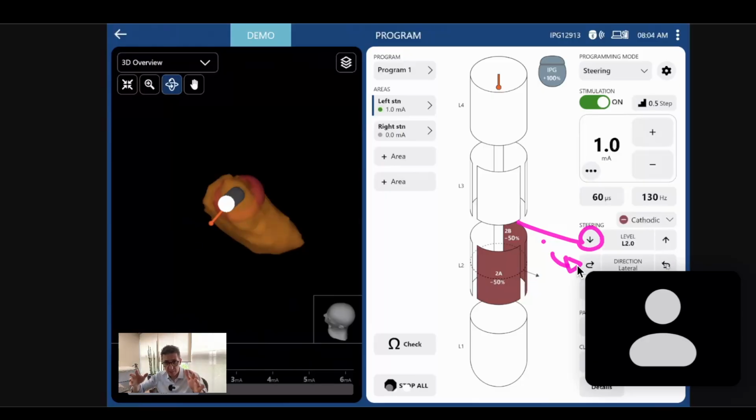And at this time, I'm seeing my patient, I examine, and I'm passing through the best contacts. And then you are going to decide, and then you're going to start programming. Remember, when you start programming, you're going to put low energy, on average 0.3 milliamps. And then after 7 days, 0.5 or 0.6.